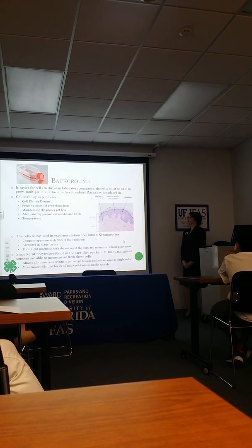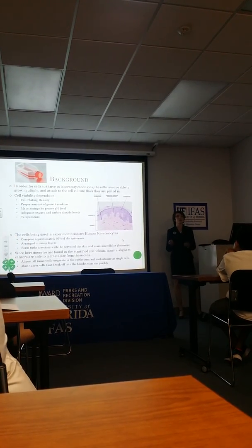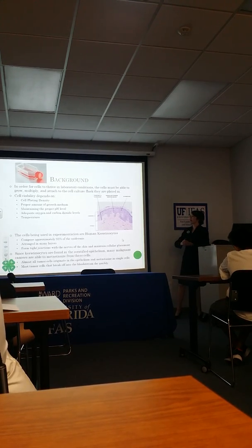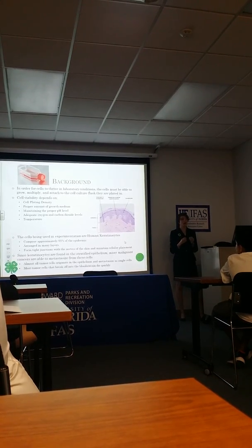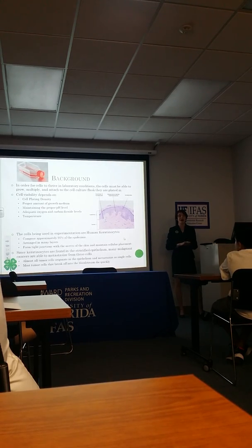So, some background on my project. In order for cells to grow and thrive in lab conditions, the cells must be able to grow, multiply, and attach to the cell culture flasks. The cell culture flasks that I used in my experiment, pictured in the top left-hand corner, are small flasks in various sizes where the cells that you are using for your project are able to attach and grow in this laboratory.